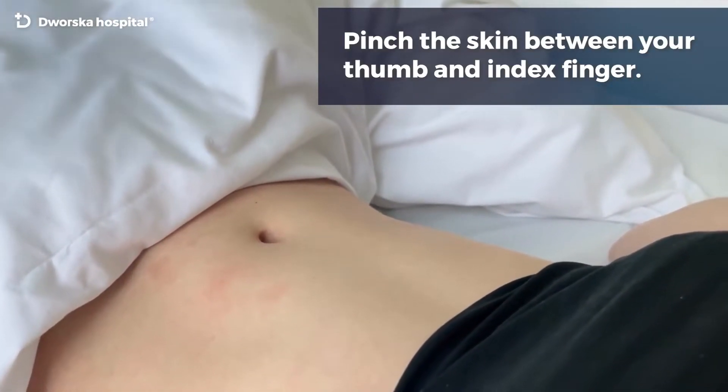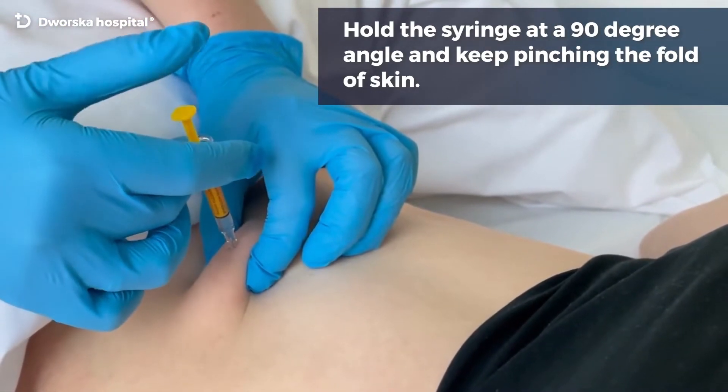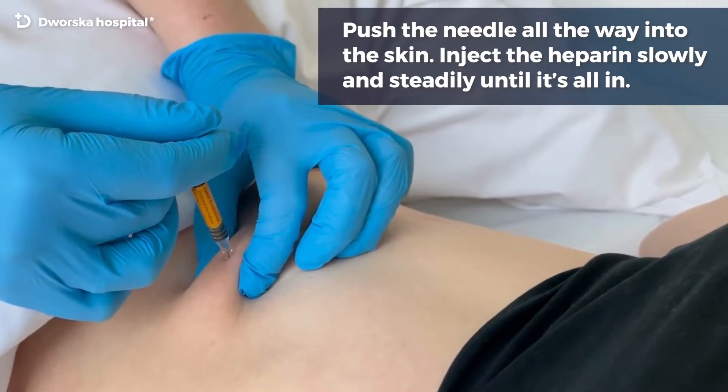Pinch the skin between your thumb and index finger. Hold the syringe at a 90 degree angle and keep pinching the fold of skin. Push the needle all the way into the skin. Inject the heparin slowly and steadily until it's all in.